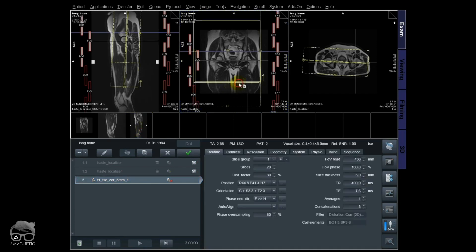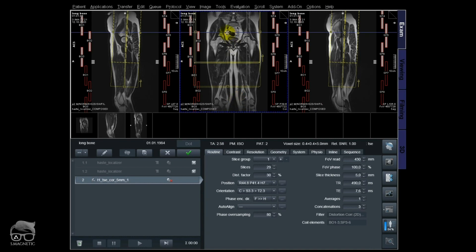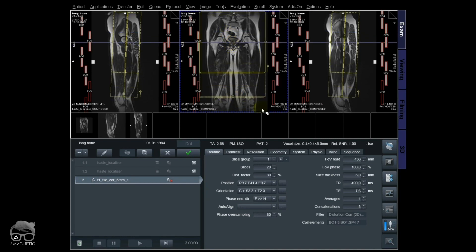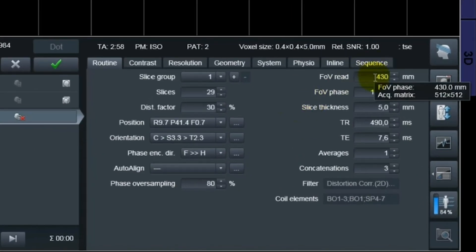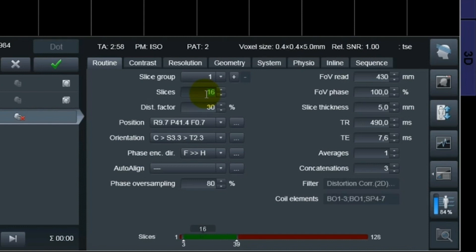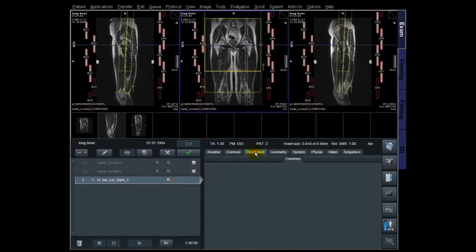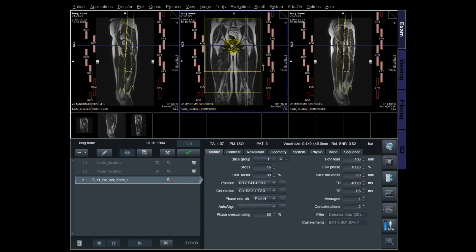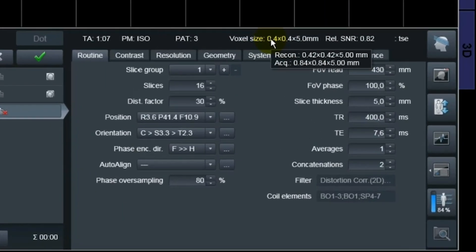So this is just a localizer — I'm going to tweak this sequence a little bit to make it faster than 3 minutes, just to show you. You can see here that the field of view is 430 millimeters, which covers a lot. I'll just cut a few slices to save some scan time. We're still at 430mm, and the acquired voxel is 0.84 × 0.84 × 5mm — square voxel sizes — interpolated down to 0.42. Let's scan that one.